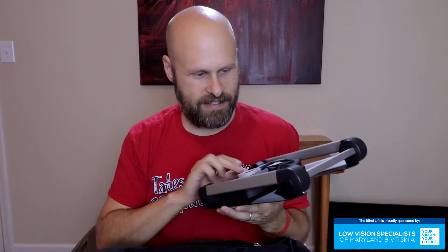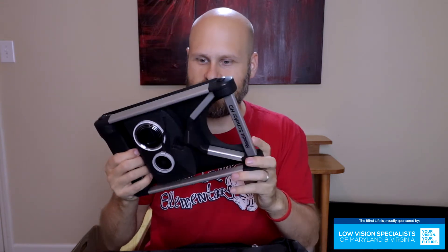You have a laptop sleeve in here, and here it is. Are you guys ready? This is it. For those of you who maybe can't see, this thing is about the size of a sheet of paper and about two inches thick. This is the CCTV.